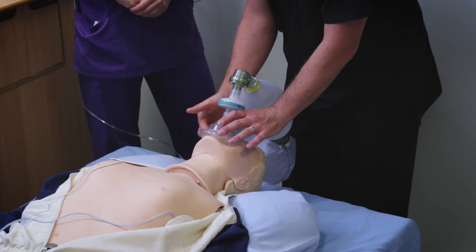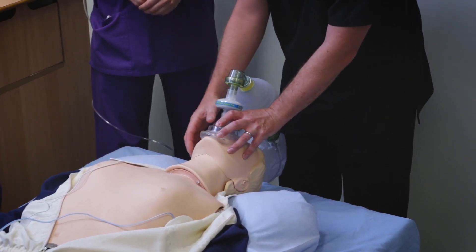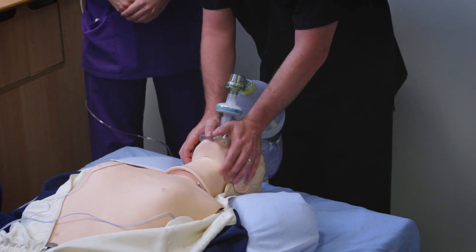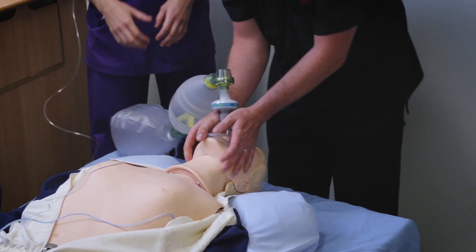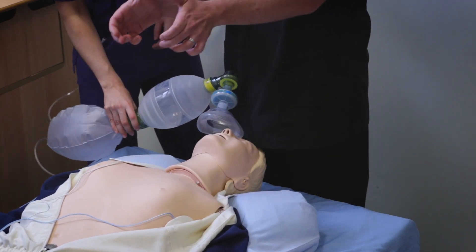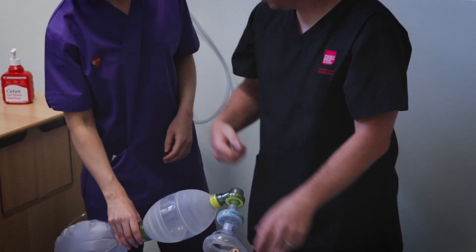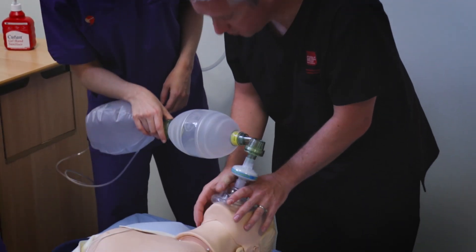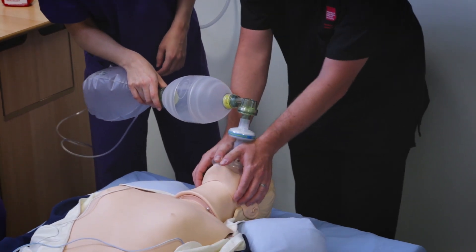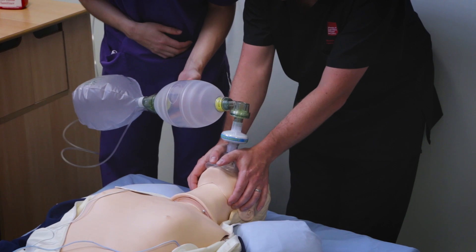Don't touch the gasket and make sure your fingers aren't touching any soft tissues — all of that will hinder your ability to maintain the airway. The movement you're doing is pulling the head back, lifting the mandible up, and squeezing the mask down. It is quite a physical movement, so don't worry about hurting the patient — it's very important that the airway is maintained.